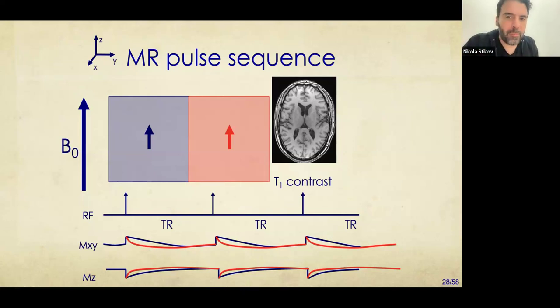Usually for my students, I ask them to develop intuition about this, but for you, I'm just going to try to interpret these T1 values. In the ventricles, we have liquid. The liquid has very long T1 values, on the order of 2, 3, maybe even 5 seconds. So because these T1 times are very long, the magnetization takes a long time to recover. And because that is the T1 time, that is the recovery of the MZ, of the longitudinal magnetization, that means these magnets have no time to recover and they will appear dark on a T1 weighted image.